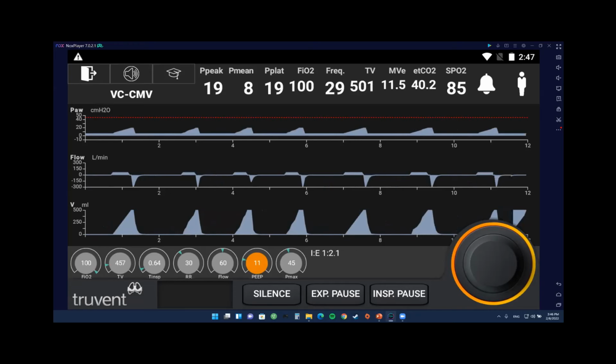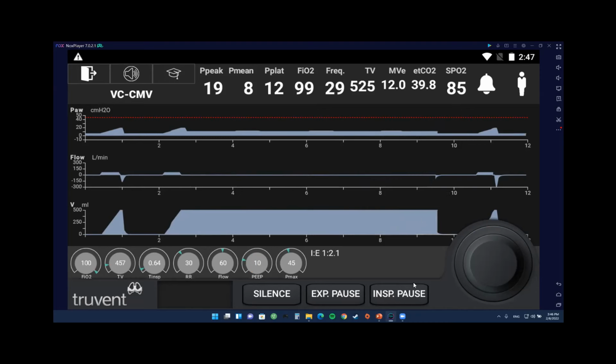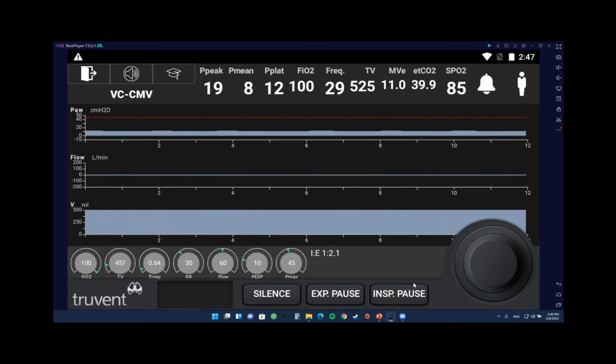What do you expect will happen to the blood pressure as we start to go up on the PEEP? It can go down because we're increasing the pressure. Correct, yes. And I see this question very often: I'm making changes on the vent, I go up on the PEEP, and the pressure starts to drop. Someone asks me, is the patient more septic now? Why is the blood pressure dropping? Because you're going up on the PEEP, and it's happening because you're giving more positive pressure.